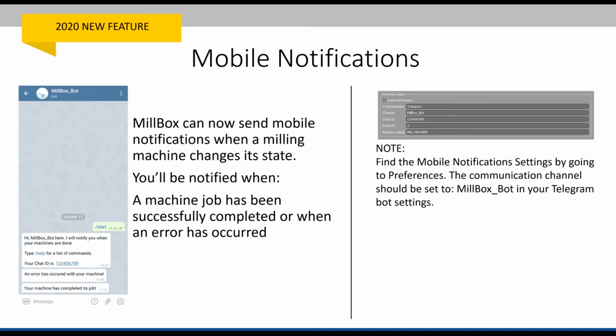Mobile notifications is the last pretty cool feature that I wanted to tell you about that you're missing out on if you're not up to date. Mobile notifications has been an option in the software for just a couple years now. It hasn't been too long. It's a pretty new feature. And what we're doing is we have a bot.